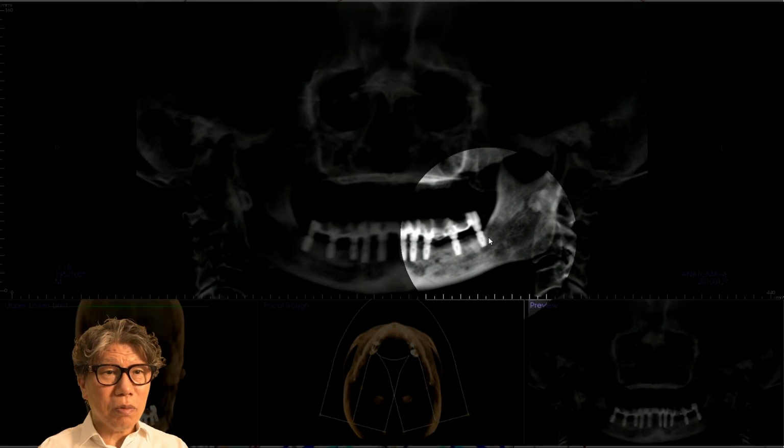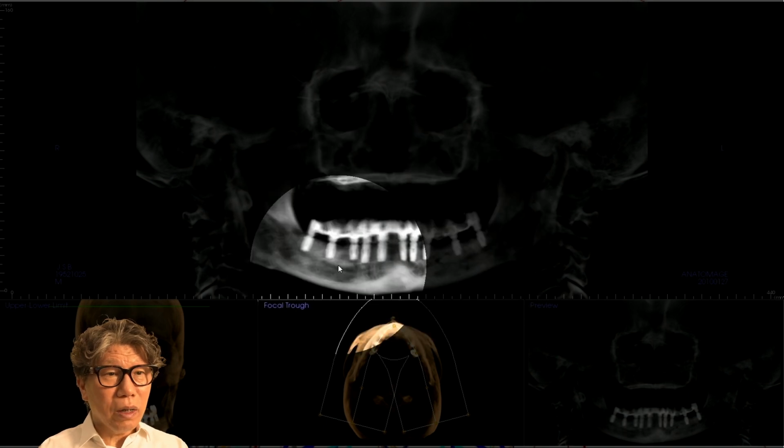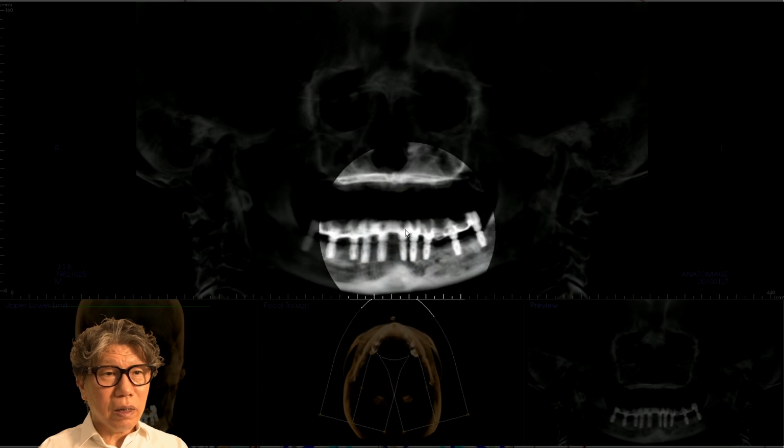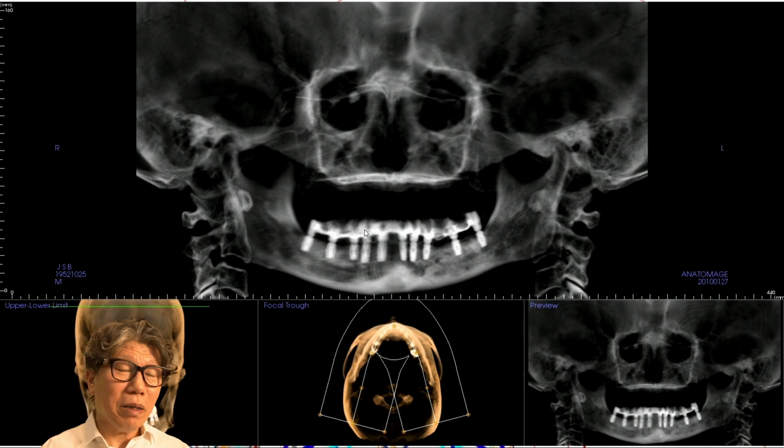Also, in most cases, the 7th tooth is not restored. So it became all on 8. And if they cannot be implanted at the back, it becomes all on 6. The fully bone-anchored prosthesis done with all on 6 is recently often advertised as all on X. It seems that there are some individuals who gain significant economic benefits from that technology. So he considers that technique special. It is a technology that has existed for a long time. The reason multi-unit abutments are sold a lot overseas is because of that, but it doesn't work well in Korea. Because the occlusal force is strong, it cannot withstand well.